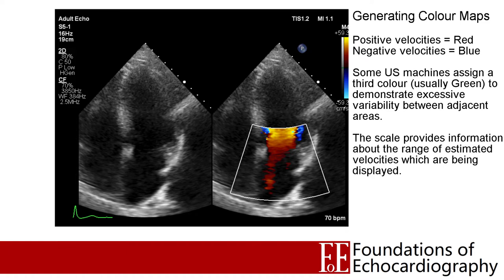Here we are back in our apical 4 chamber view with two images side by side — the plain 2D image on the left and an identical image with a colour box overlaid on the right. From the ECG the image is frozen at mid-diastole, towards the tail end of early diastolic filling. We can see a band of dark red becoming bright yellow blood leaving the left atrium and entering the LV. From the scale on the right-hand side, the ultrasound machine is estimating this blood is travelling in the order of about 50 cm per second as it crosses past the mitral valve annulus.